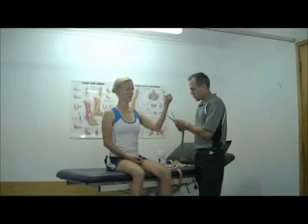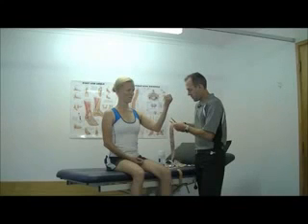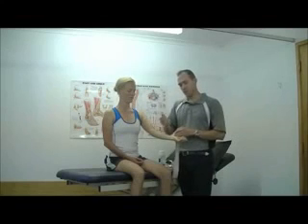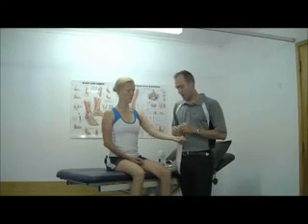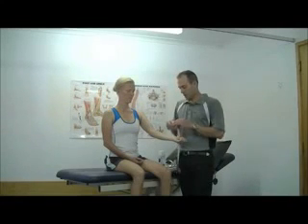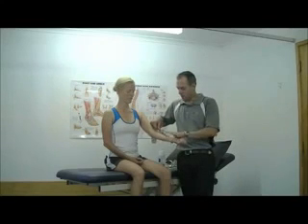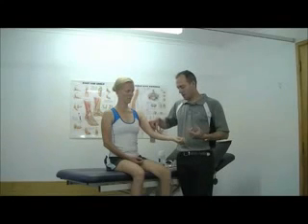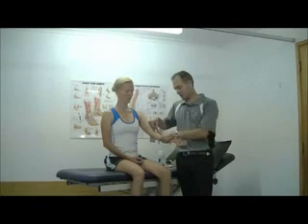And because this is a strongly elastic tape, it's very important to try and reduce the risk of blistering. With any tape, if it pulls strongly on the skin for a period of time, it can cause a mechanical irritation or what we call a traction blister. The way we avoid these is by applying the ends of the tape with very little or no stretch. When you're first beginning to use the dynamic taping, I suggest you allow at least 5 or 6 centimetres without any tension on it.